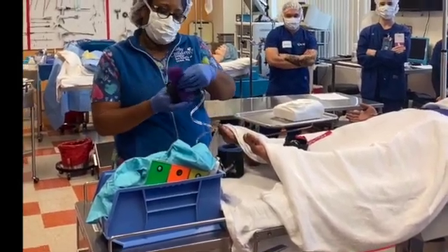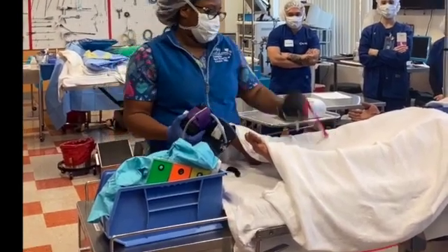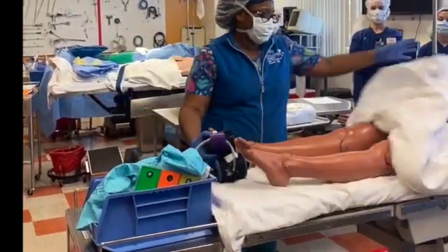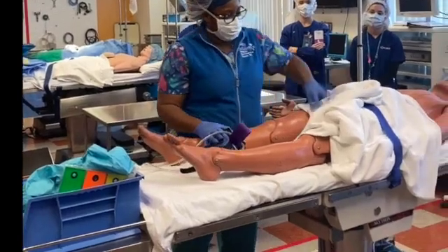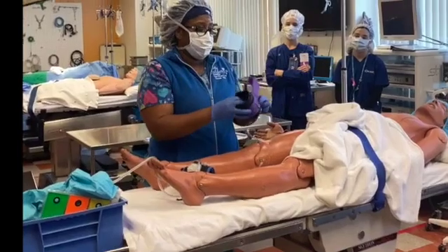Alright, so purple is 34 inches. Blue looks a little bit bigger. And that one's the smallest. Let's check this leg. Keeping the patient covered for privacy. We're coming all the way up here, but I just gotta make sure I got the right size tourniquet.